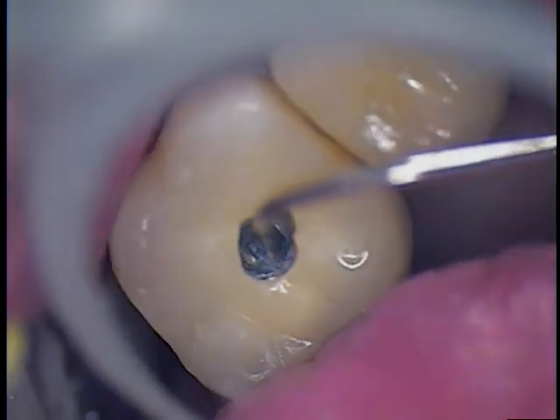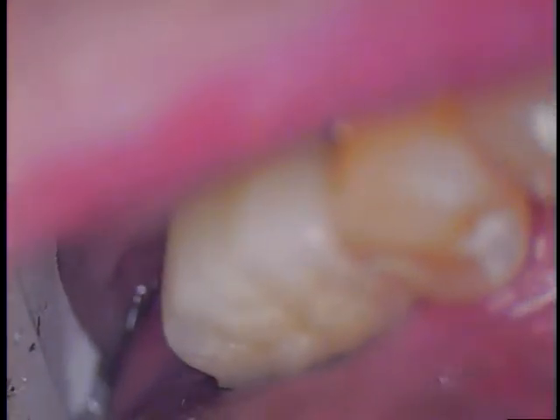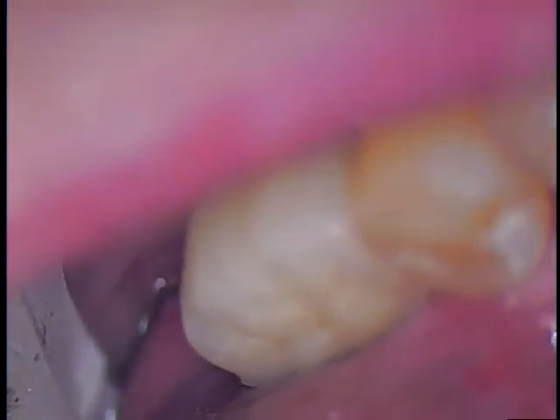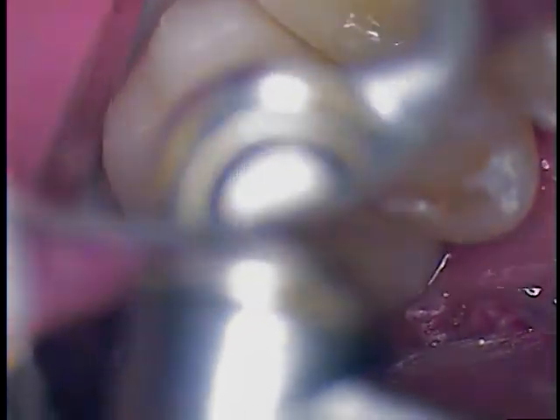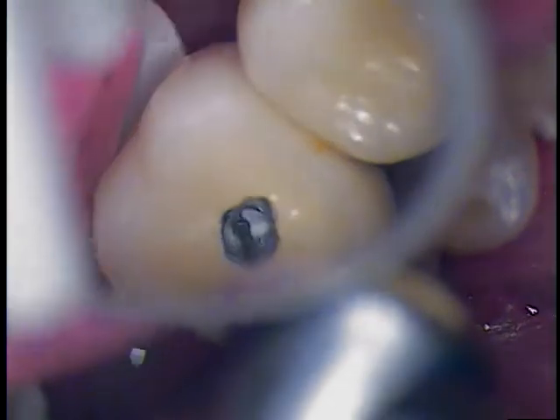Looks like we filled the entire chamber with the Reliax cement. So I'm just going to take a round burr and go slowly just to remove the cement, a little at a time. We're going to spray a little air in there — I've got to go gently until we find the screw head.